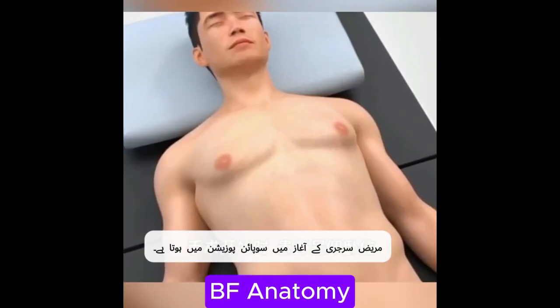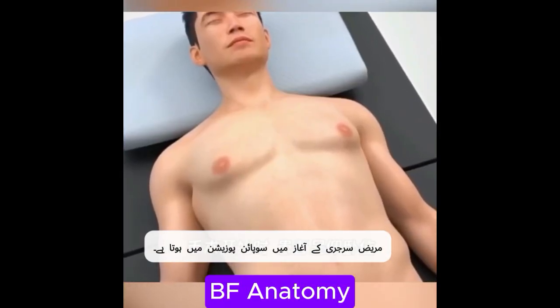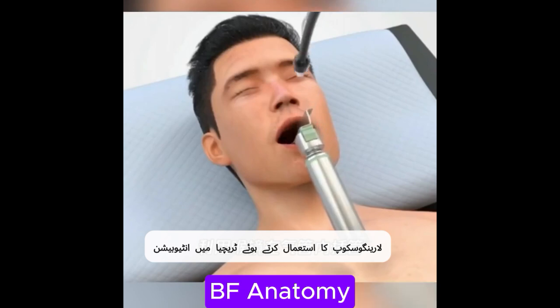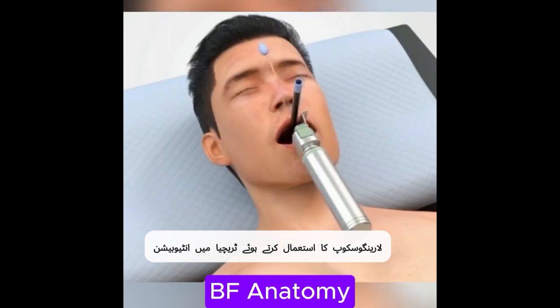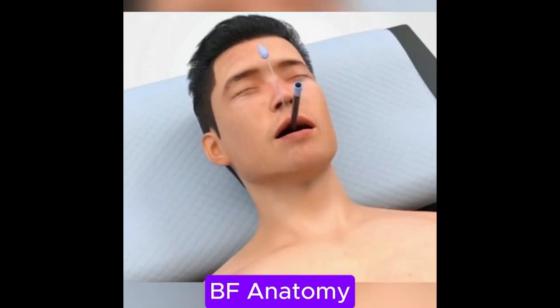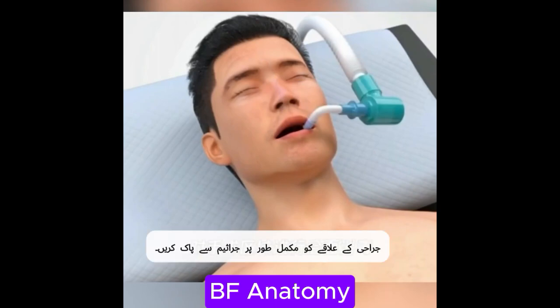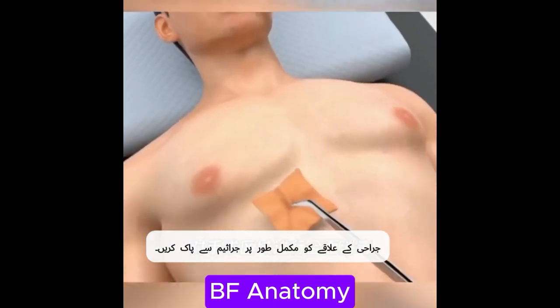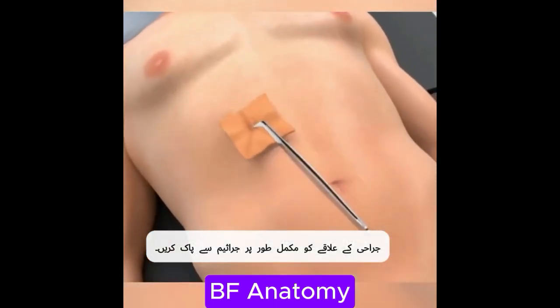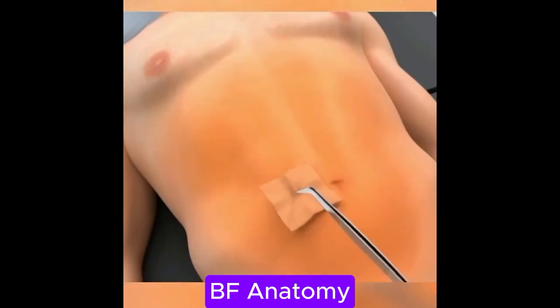At the start of surgery, the patient is positioned supine. General anesthesia is administered via tracheal intubation. After anesthesia, the surgical area is thoroughly disinfected.